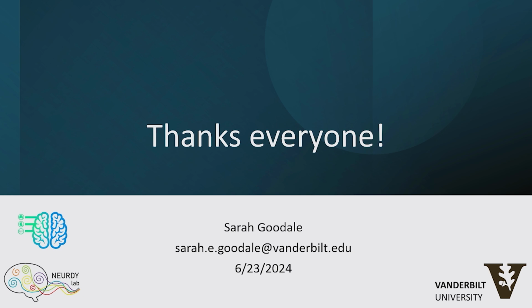Yes, that's one thing that we do. It just requires an extra checkpoint or more time, but as was mentioned before, when putting the respiratory belt on and the PPG system, when they're lying in the scanner, there's typically that period before they're sent back into the scanner where you can turn on your system or check really quickly. With the in-scanner systems, it's more difficult to do that. A lot of times those pop on when the scan is actually in session. But if you have third-party physiological data equipment, you can absolutely test that beforehand. So a lot of times what we'll do is make sure that everything looks good, the signals are appearing, they look pretty good for what we're looking for, and then we'll send them back.